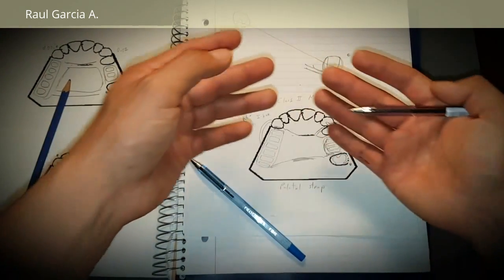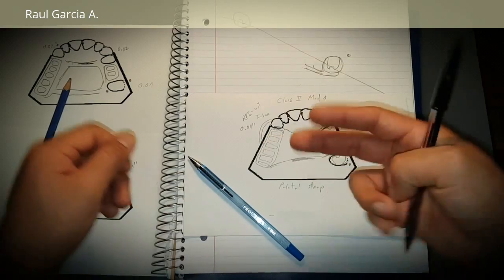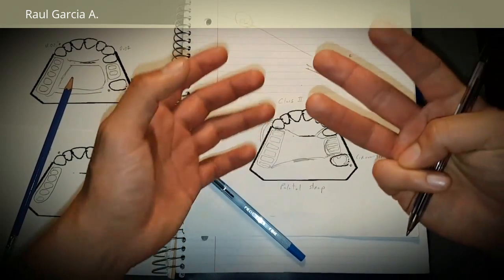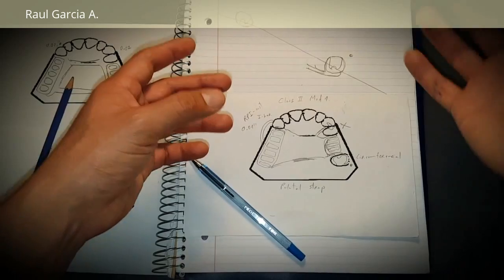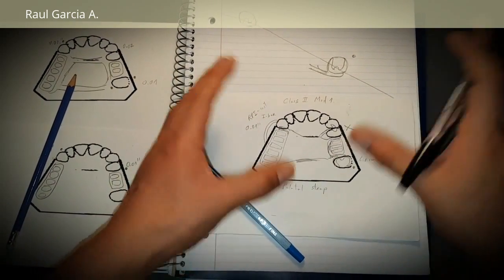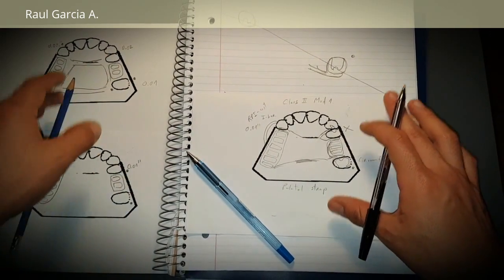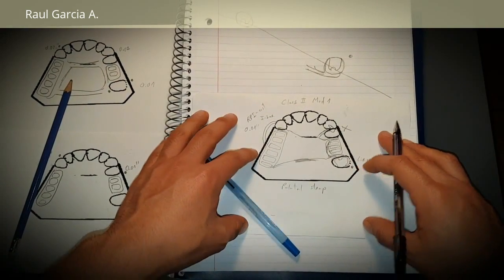That was in a class 1. Minimum in a class 2, minimum is 2 clasps. Ideally, if you have 3 teeth, then you want to have 3. That's ideally, if the undercut allows it. Okay? The position of the tooth, the interocclusal space, the condition of the tooth, etc. Okay? So I'm going to show you the same case in 3 different scenarios, slightly changing things.